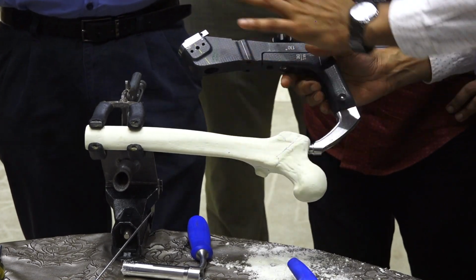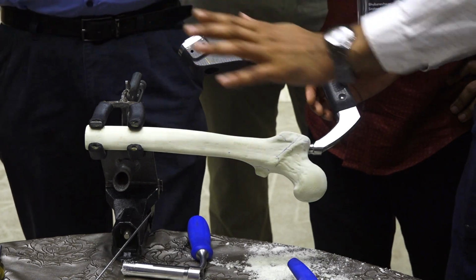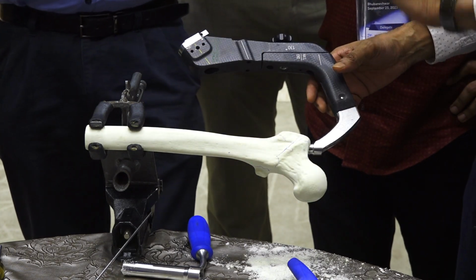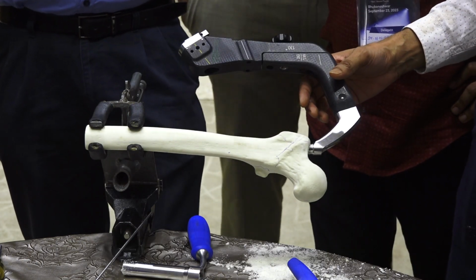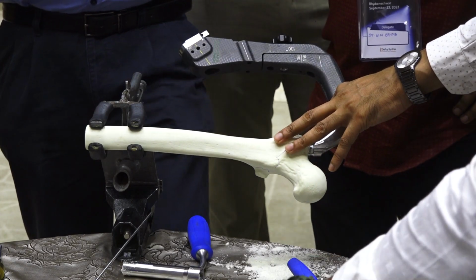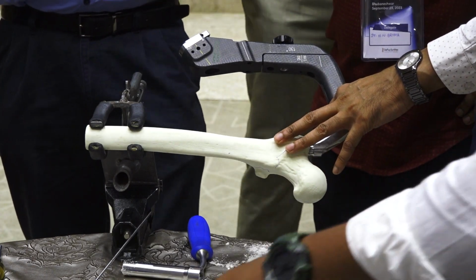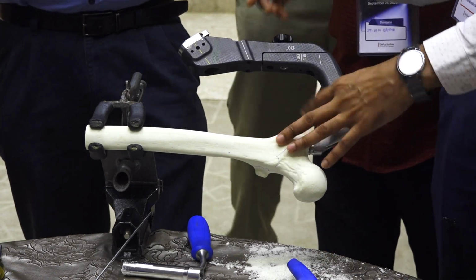And don't hammer the nail from the very beginning. You have to push the nail almost 90%. In a short nail it should be only by push, no hammering. In a long nail almost 90% of the nail should go freely. Only the terminal part you can hammer. Before that you have to check in the lateral view of the knee that it is not abutting the anterior cortex, or else it will perforate.